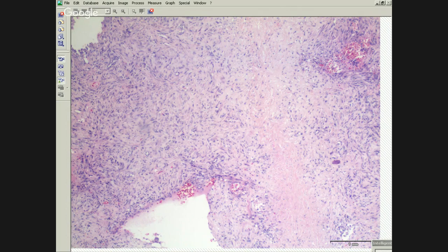So sarcomatoid mesothelioma should be keratin positive, and they're usually reasonably so. You can get some that are kind of wimpy, but for the most part, it should have pretty decent keratin staining. So that's the most important thing. So essentially, if you have something that's keratin positive and the disease distribution is appropriate and it all fits together, then that's really strong enough to go ahead and call something sarcomatoid mesothelioma, provided he's got the right disease distribution.